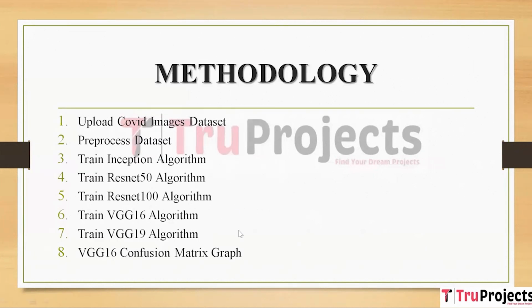Methodology. To implement this project, we have designed the following modules. The first module is Upload COVID Images Dataset. This module involves obtaining a dataset of chest X-ray images, some of which contain SARS CoV-2 infection, COVID-19, while others represent non-COVID-19 cases, normal or other lung diseases. The dataset is essential for training and evaluating the AI models.